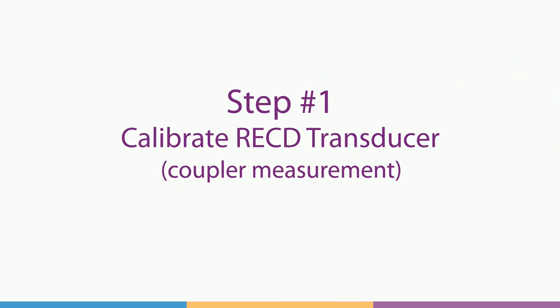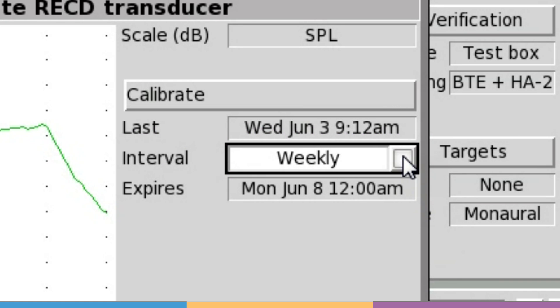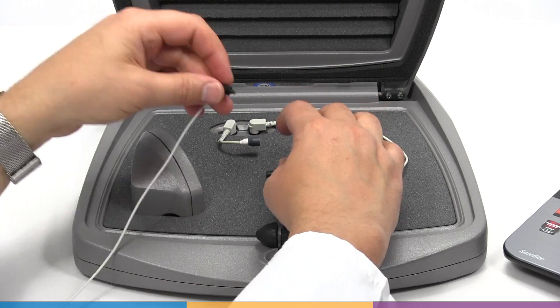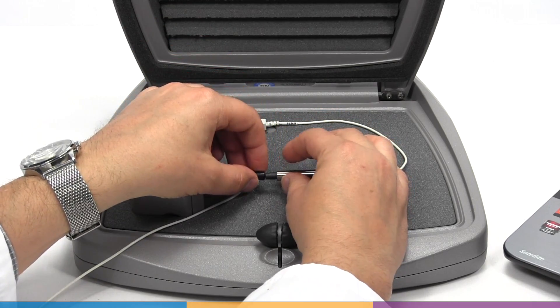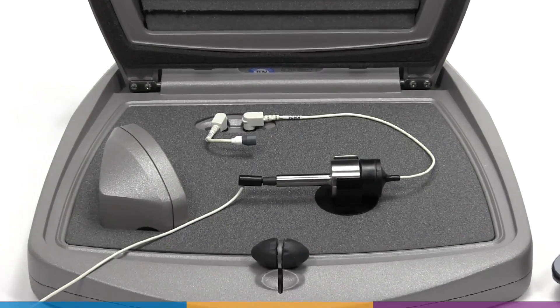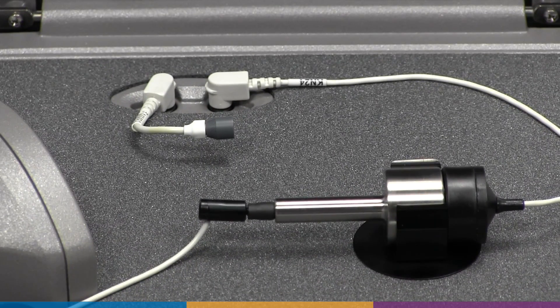RECD starts with a calibration of the transducer in the coupler. This measurement can be stored weekly and will expire every Monday morning. On the Axiom, RM500SL, and Legacy Verifit products, this is done by connecting the transducer to the 2cc HA2 or BTE coupler. RECDs are now expressed in HA1-referenced values, but we use the HA2 for coupling convenience and convert this automatically in software.